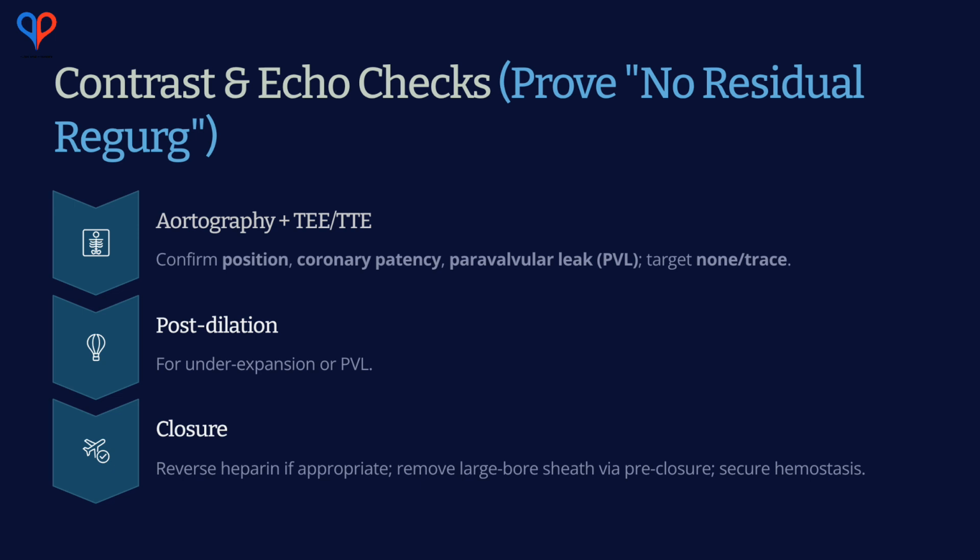If there's underexpansion or significant paravalvular leak, we can perform post-dilation. Once imaging confirms a stable result with none or only trace paravalvular leak, we secure hemostasis at both groins and proceed to intensive care unit level care.